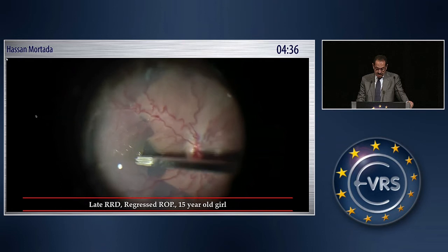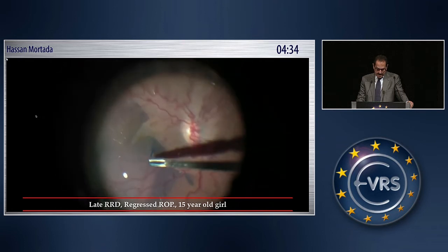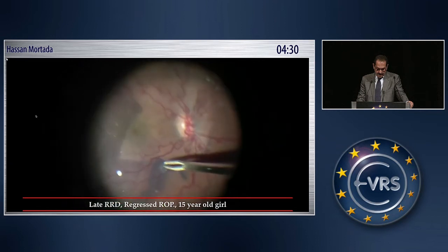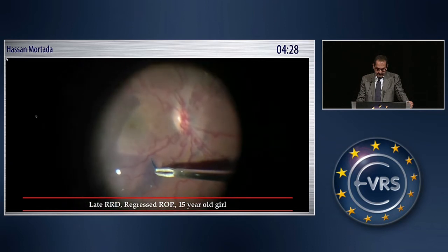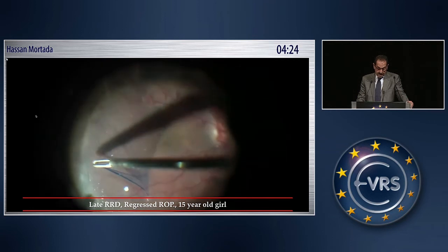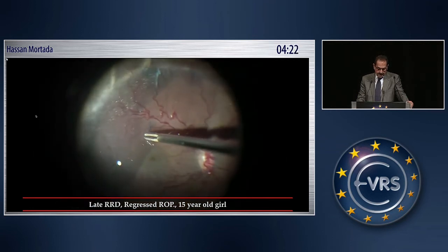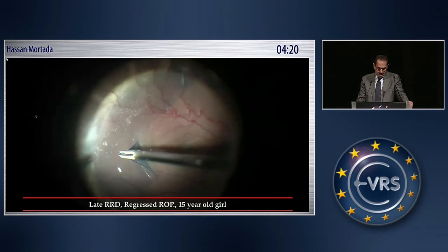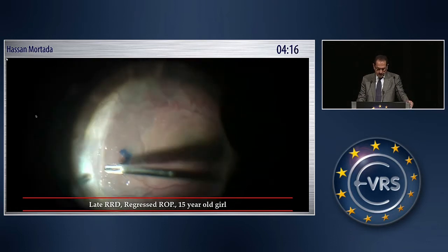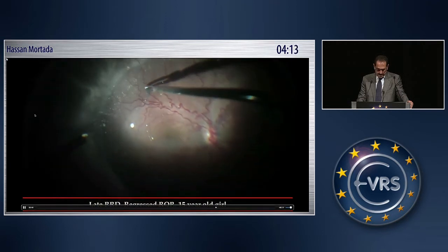Then the ILM is peeled. You see the peeling is started with the use of the Tano scraper, and then the retina is stabilized with PFCL. The ILM is peeled extensively, trying to reach as far peripheral as possible — in some cases you can reach up to the equator, but this is not usually the case.